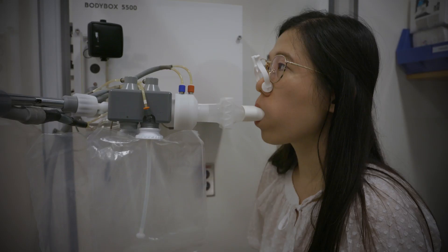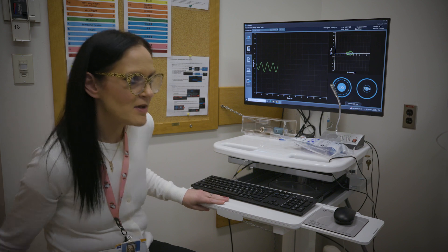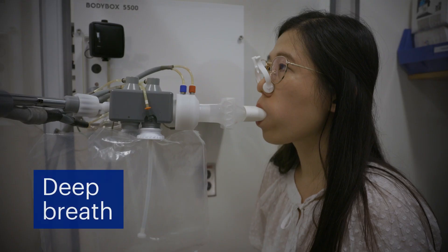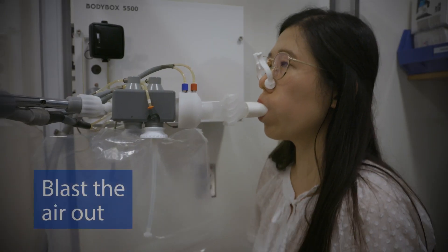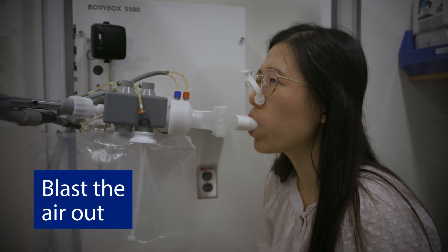Next, the technician will tell you to take one very deep breath all the way in, filling your lungs completely. Then, you'll be asked to blast the air out as fast and hard as you can.